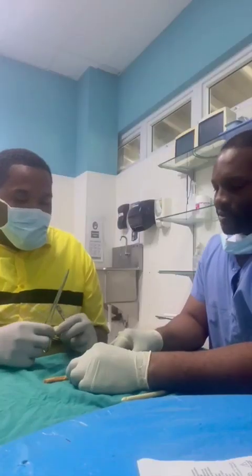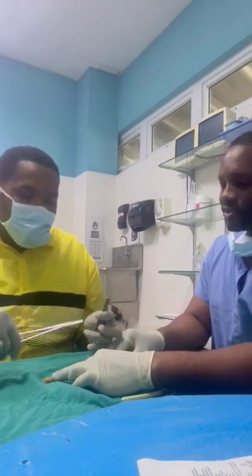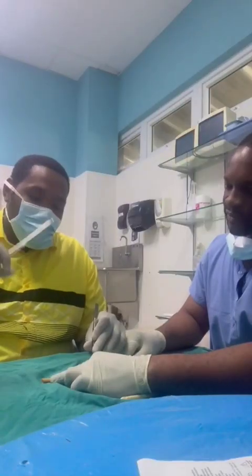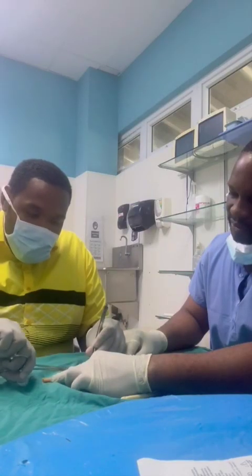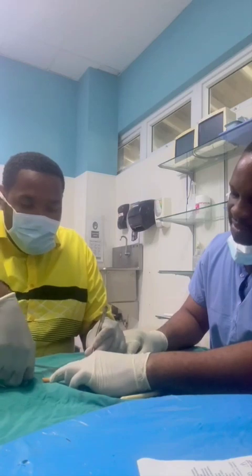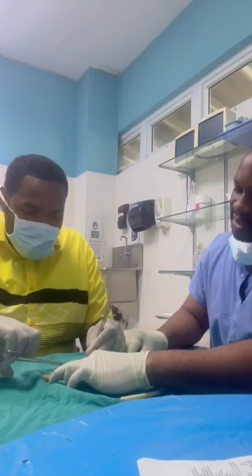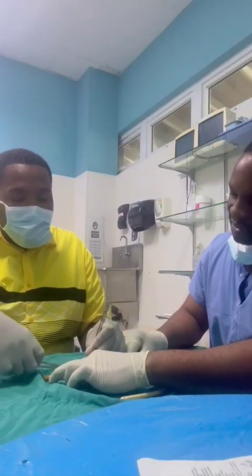And now, do you want me to do another? Sure, you can do another, sir. You have to do it twice. Very good. So, half and half. Is it 90 degrees? Yes. I rotate the wrist. Excellent. And now I see you're holding the tissue with your tissue forceps. One of the common mistakes is to hold the needle with the tissue forceps. So you're doing very well.